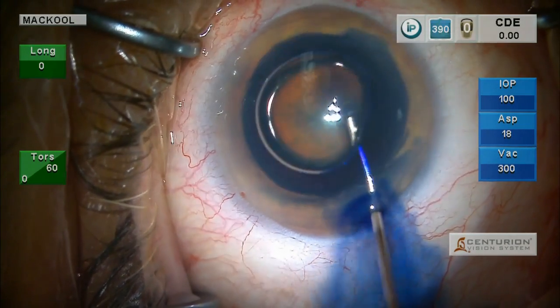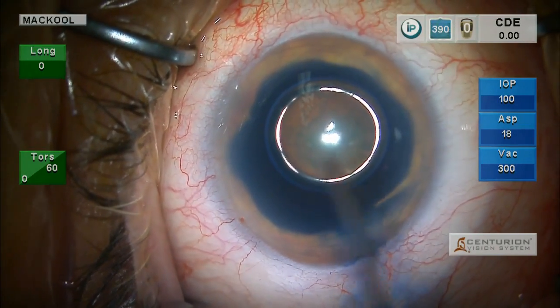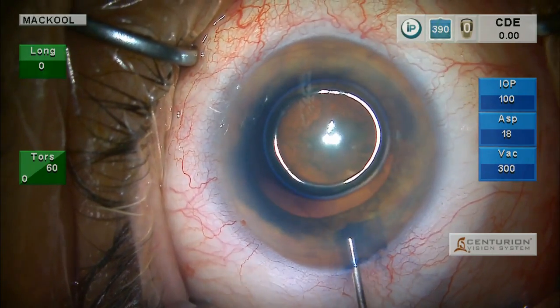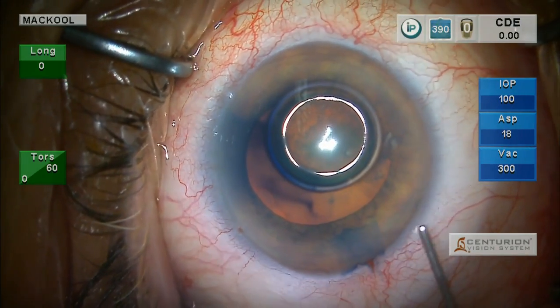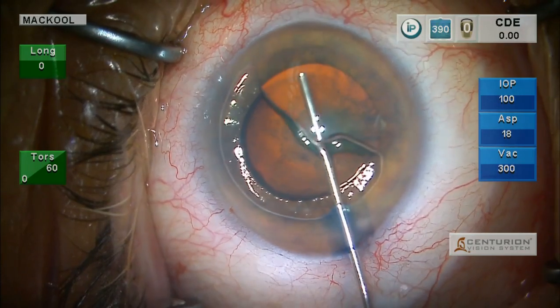The zonule may be weak during the procedure, obviously. You may need to use retractors. If you stain the anterior capsule, you can see the capsule, and at any point during the procedure it's easier to place retractors. So I like to stain eyes with pseudoex.